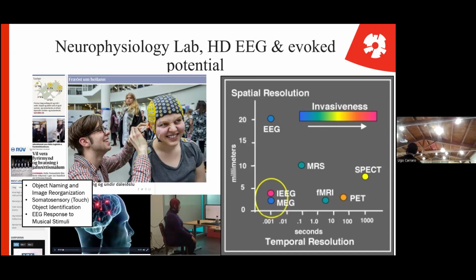With functional MRI, we see very detailed images that are mostly static because they evolve very slowly during MRI acquisition, while with EEG we have a very high temporal resolution, so we can track in a few seconds a lot of information. And besides the fact that in a research lab in a university, having an MRI is not an obvious thing because it's quite expensive.